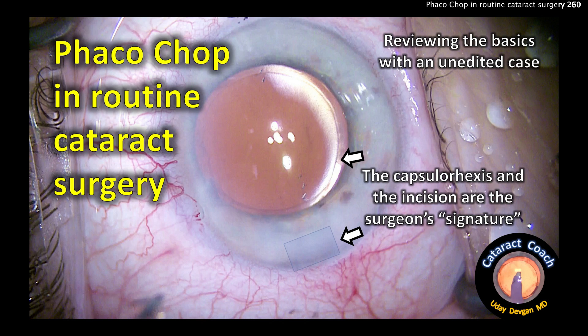CataractCoach.com. PhacoChop in routine cataract surgery. Remember, your rhexis and your incision are your signature.